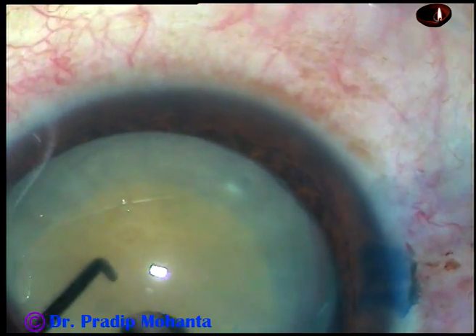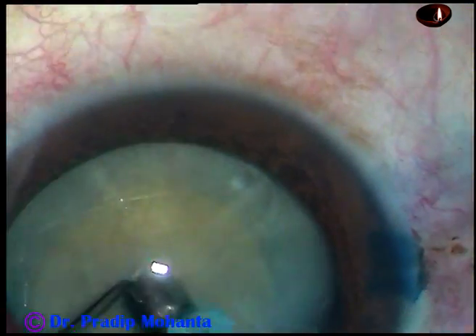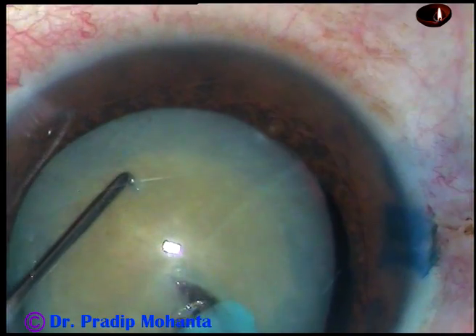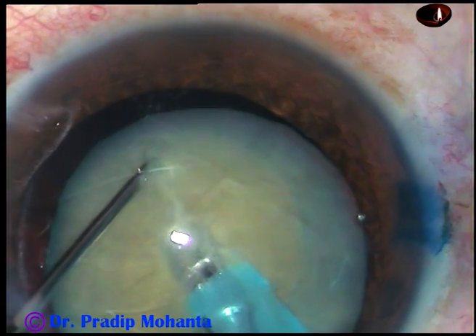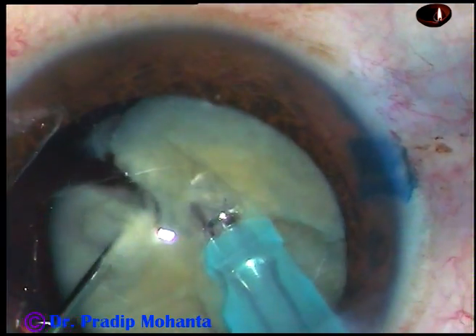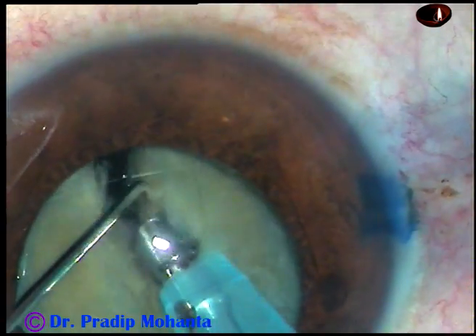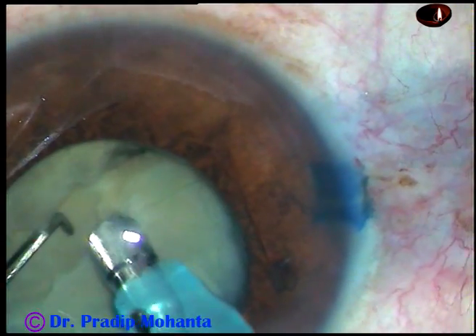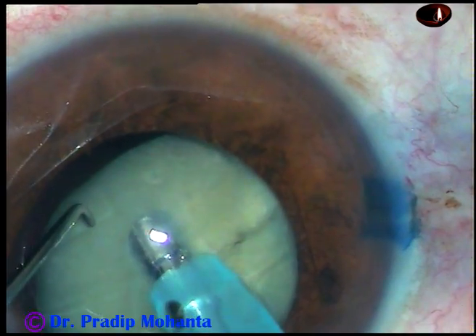See how to hold the nucleus — the first attempt failed. Then, with bevel down, I could go into the substance of the nucleus, moving through it. You can chop it very nicely, but in this case there are some leathery fibers and the two pieces did not get separated completely.